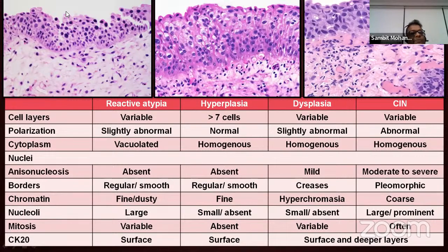Dysplasia. Yes, you will sign out probably. This is a good case for dysplasia because the abnormality is there, but it is not as pronounced as a CIS. You have some hyperchromasia, but the basal cell is maintained, but you do not see the typical school of fish appearance or the syncytial appearance of a reactive atypia. There is no clear cell change, but some cells are trying to drop out and becoming very, very hyperchromatic. However, the cell size is smaller than the CIS. So you would probably write this report as flat urothelial dysplasia, comma, see comment.